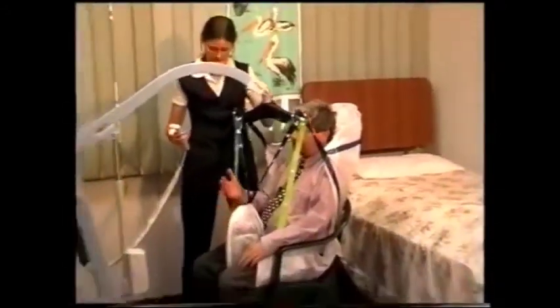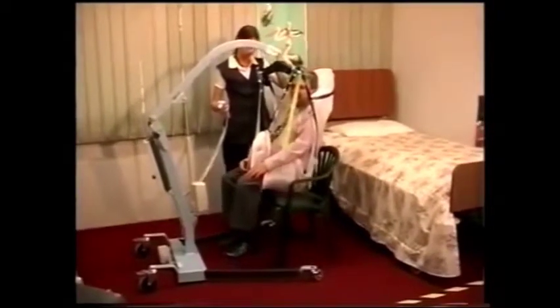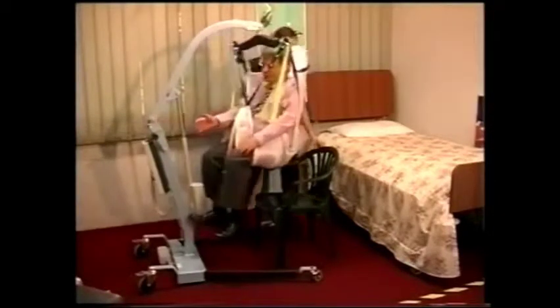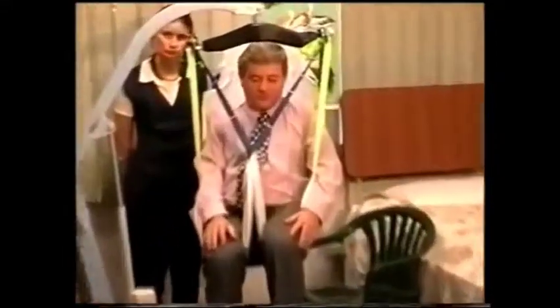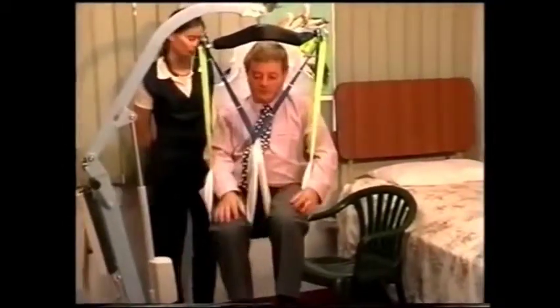Watch the hoist, it's coming in. Now, I swung a little bit when I came up then, but otherwise it's fine. I just turn myself around here. Now you can open up the legs or close the legs, whatever you like. If you want to do washing after toileting, you can open up the legs there and wash in underneath. There we go. And you can do all the washing and then keep it over.